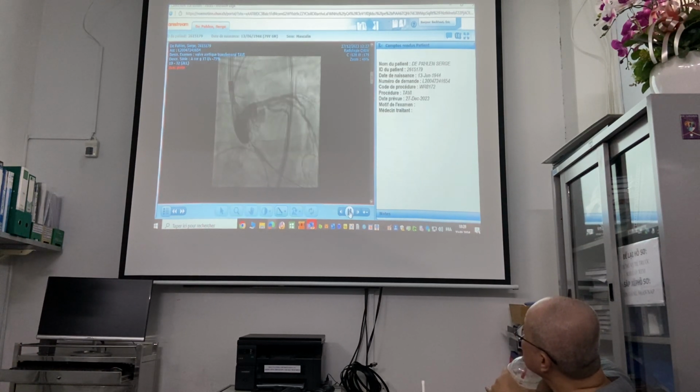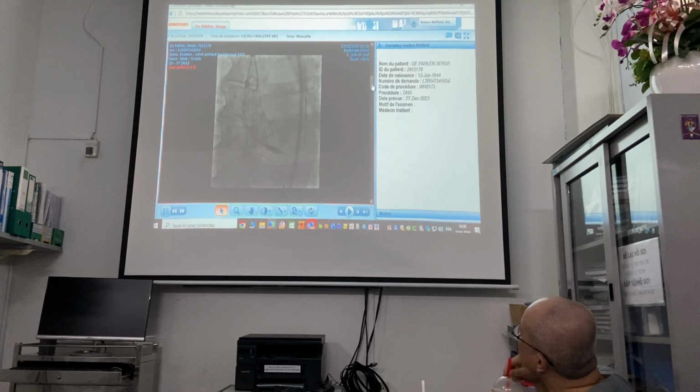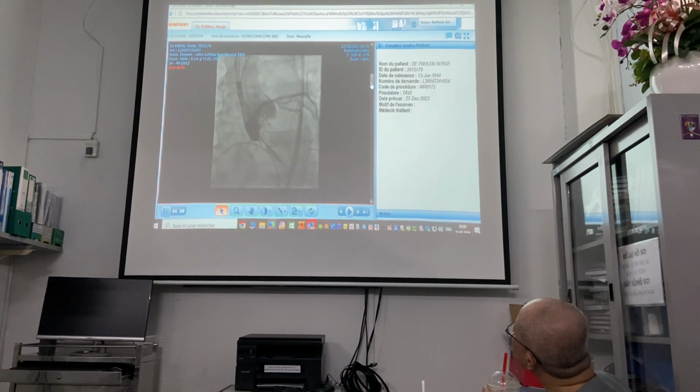You will see that soon. Okay, so I think now we have recaptured and put it a bit lower. Okay, now the complication already. So now the valve is fully deployed, steady, but look carefully what happens. Just look now and tell me what you see. Look carefully now.